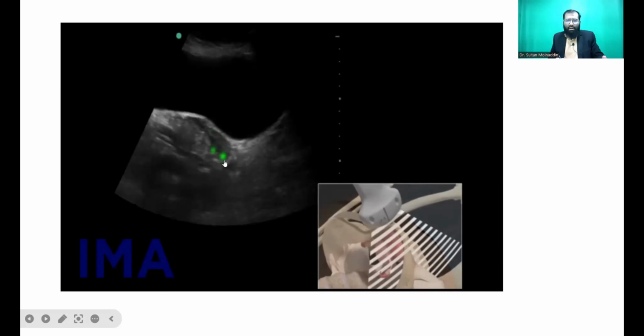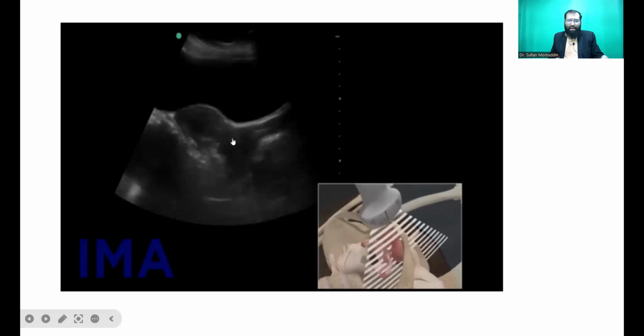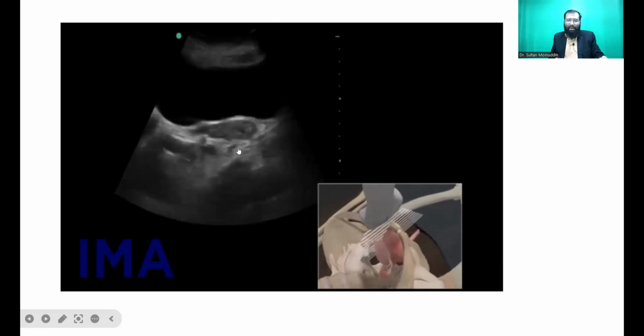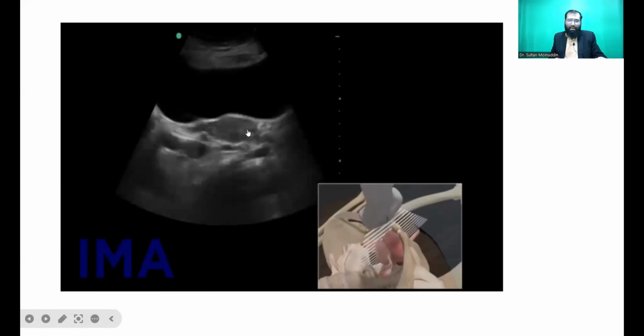These are the ovarian follicles. Now, if you see the angle with the cervix, it is slightly posterior, and that is because of the LSCS scar. Now, this is the ovary on the opposite side. Again, it is showing follicles. So, this is how a normal ultrasound of the ovary should look like.